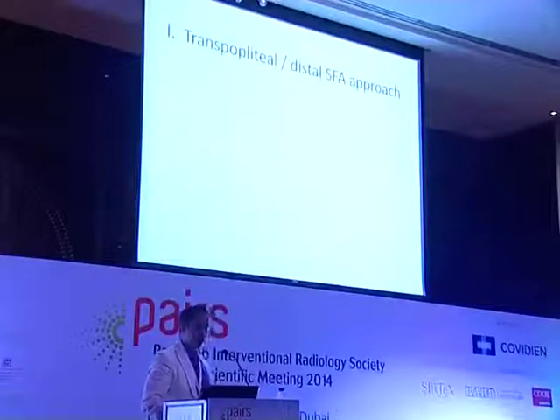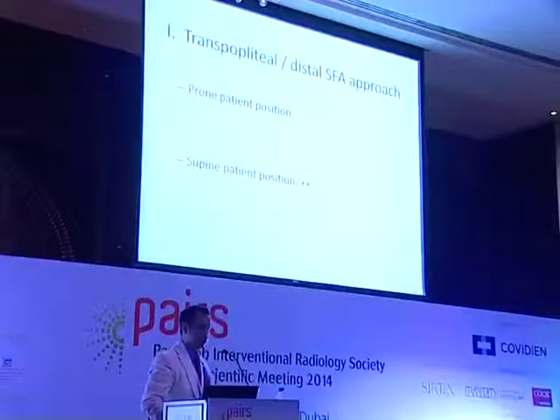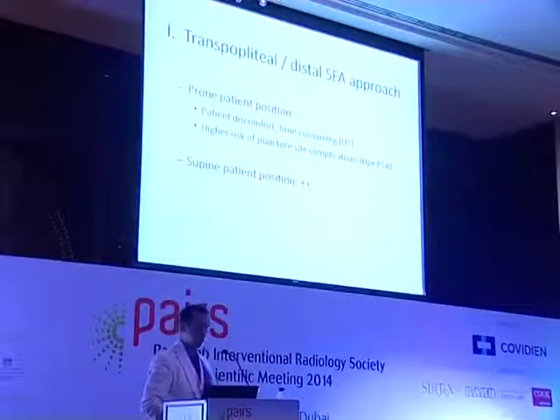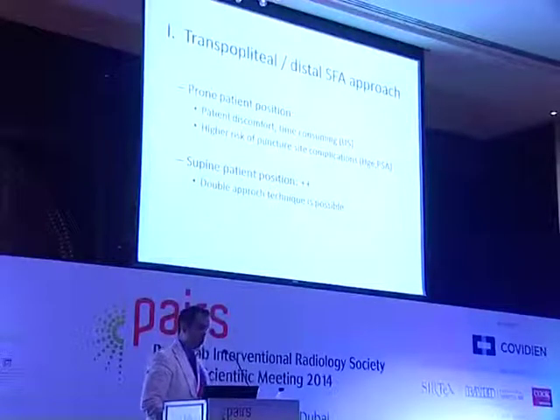Let's talk about the transpopliteal distal SFA approach. We can have the patient in the prone position or supine position, but we prefer the supine position because the prone position is less comfortable, it's time-consuming with ultrasound puncture, and a higher risk of puncture site complication like hemorrhage or pseudoaneurysm. The supine position allowed us also to have a double approach technique and could help us.